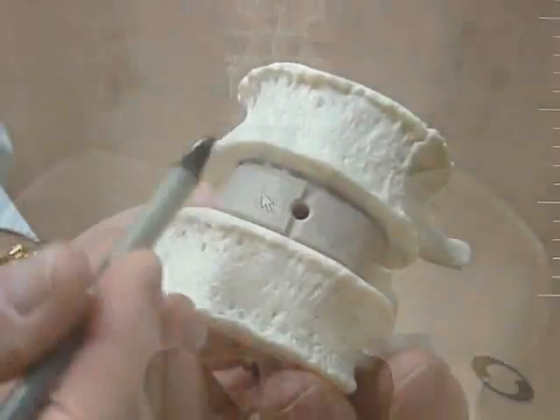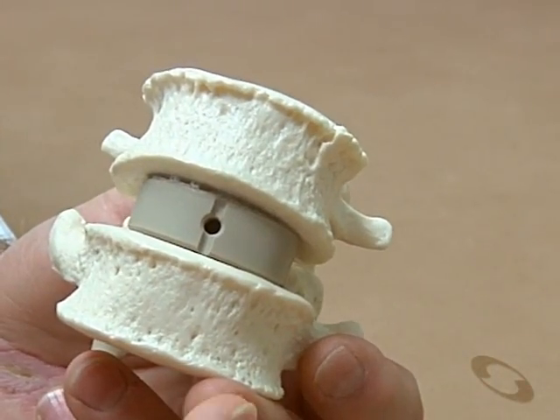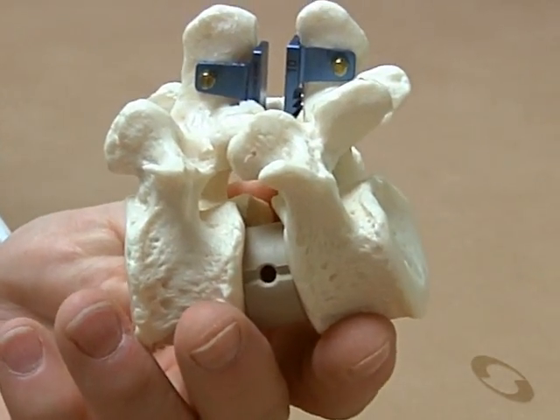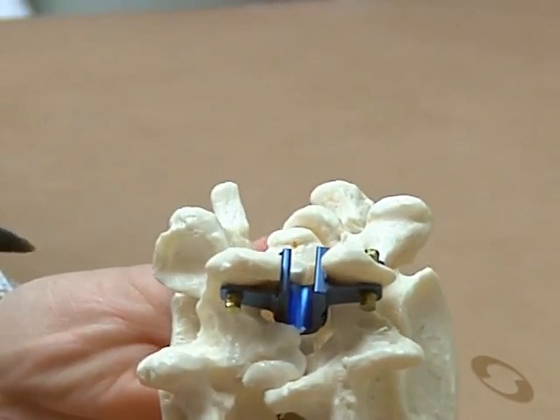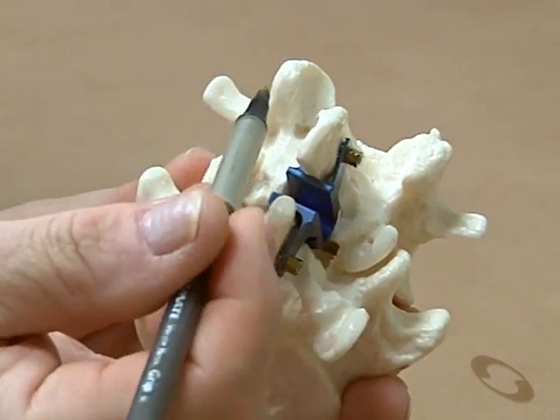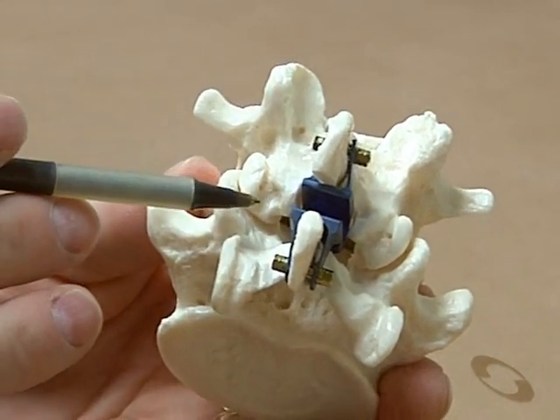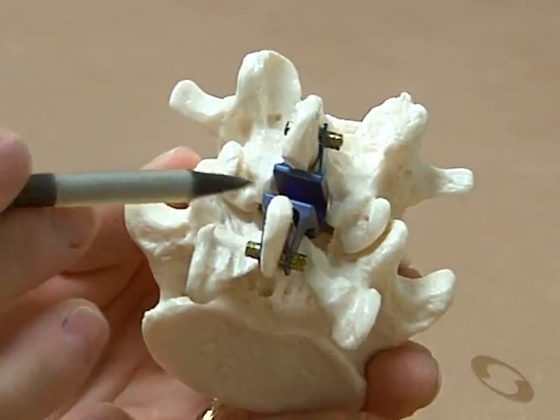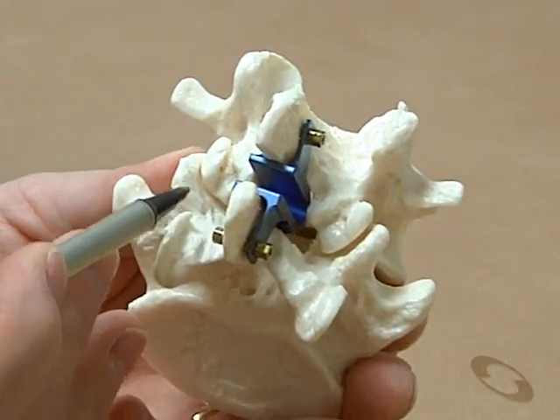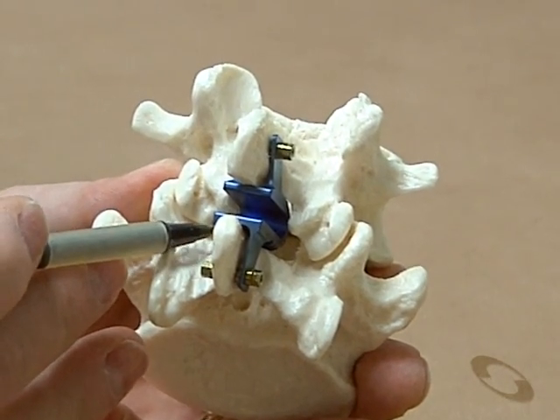After the anterior cage is plated and stabilized with screws, the patient's wound will be closed and dressed, and then the patient will be turned into the prone position or abdomen down. We will be looking at the patient in the video in this orientation, and we will be able to see the spinous processes of L5 and S1. We are going to remove the ligament complex between those two bones. We're going to remove a small portion of the bone here and here so that we can actually see the underlying neural canal and the soft tissue that overlies the nerves called the dura.